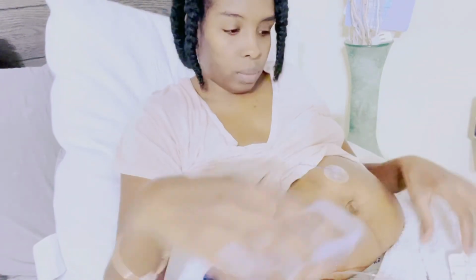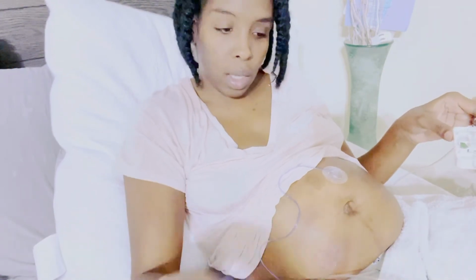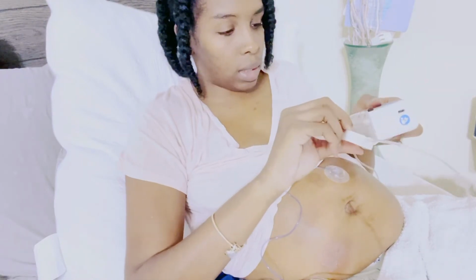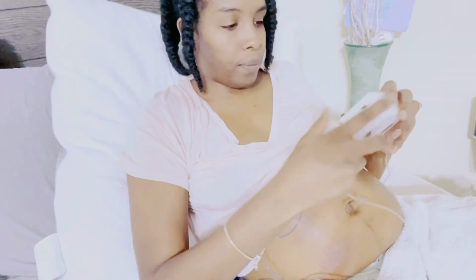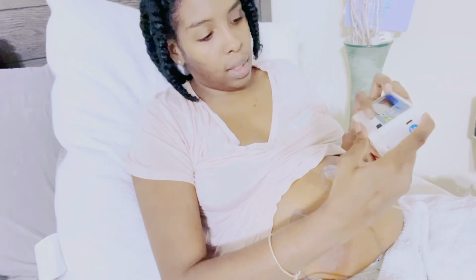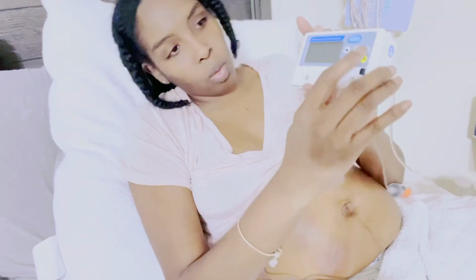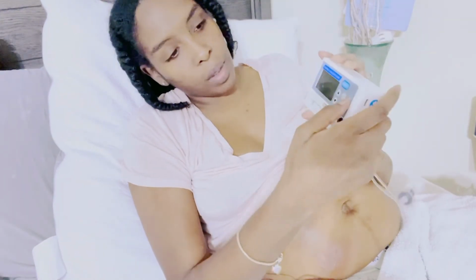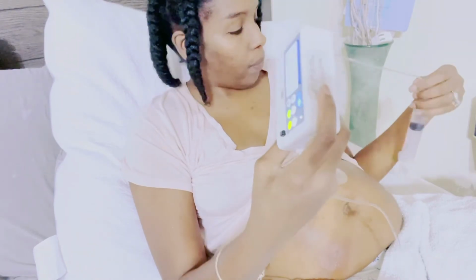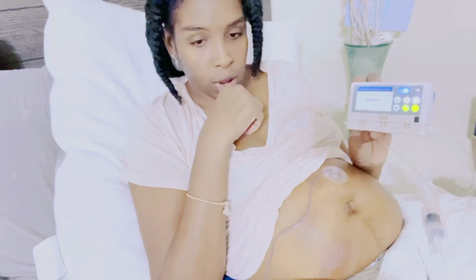So now we're gonna move all this trash out of the way. And then I'm going to put this back onto the case, and press this black button and the silver buttons, and then allow it to fall back in place like that. Turn it on with the on button here. You gotta hold it down. And then it goes through its motion.